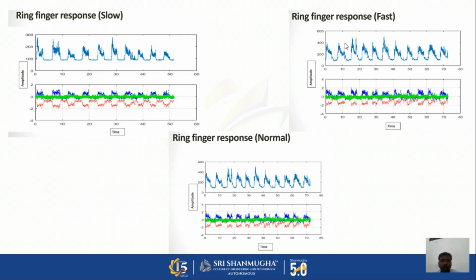So, the EMG signal response during fast movement of the finger. When the finger moves quickly, the muscles contract rapidly and produce stronger electrical signals. As a result, the EMG signal amplitude increases significantly. The waveform becomes more intense and shows rapid fluctuations. Detecting these strong EMG signals allows the prosthetic control system to recognize faster and more forceful movement of the user.